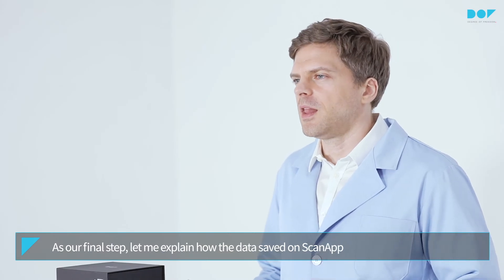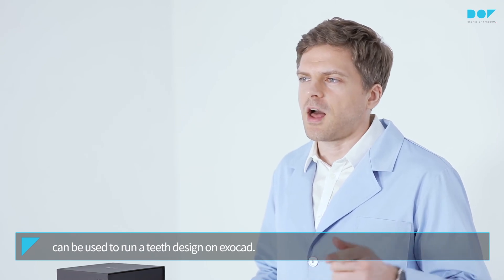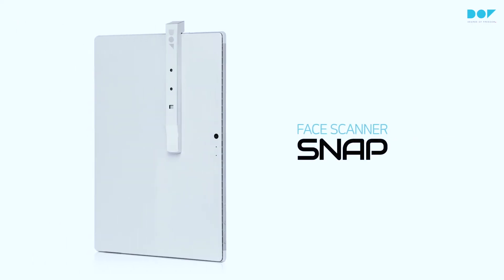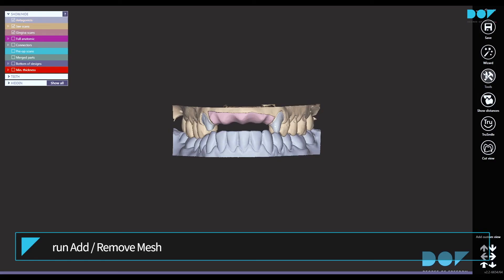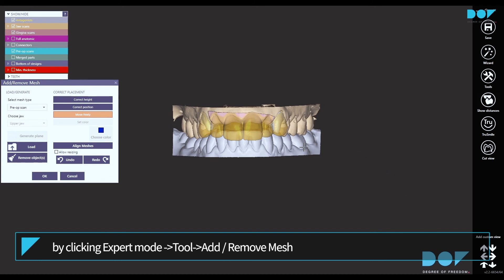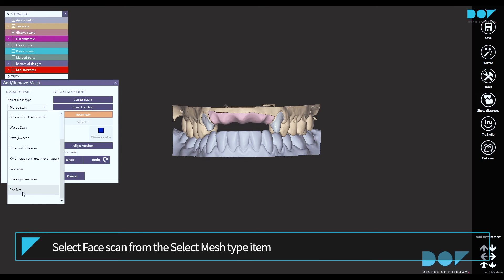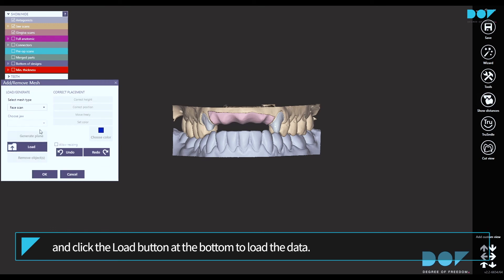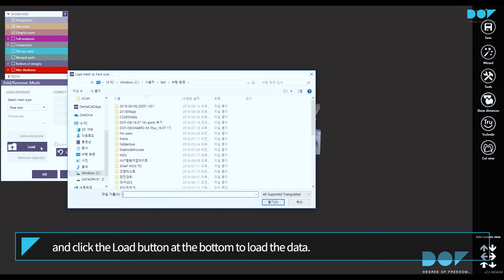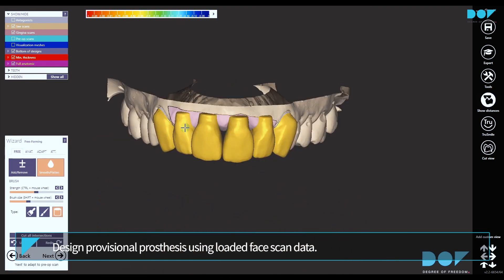As our final step, let me explain how the data saved on ScanApp can be used to run a teeth design on ExoCAD using FaceGather Snap. After loading scan data, run 'Add/Remove Mesh' by clicking Expert Mode, then Tool, then Add/Remove Mesh. Select 'Face Scan' from the select mesh type item and click the load button at the bottom to load the data. Design provisional prosthesis using the loaded face scan data.